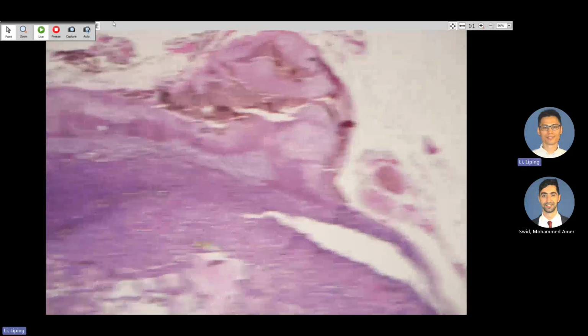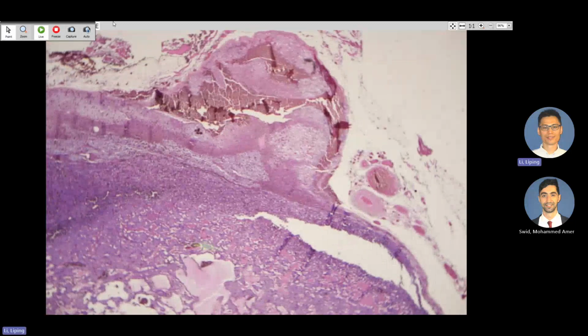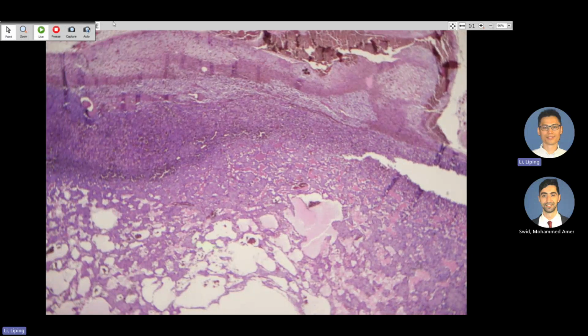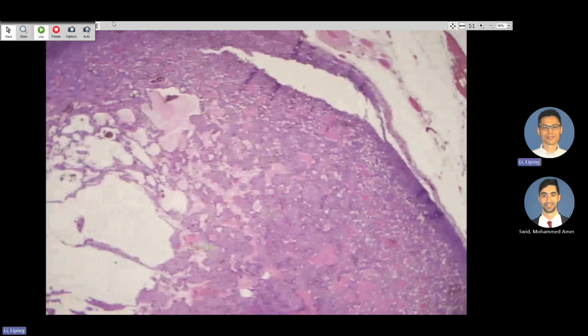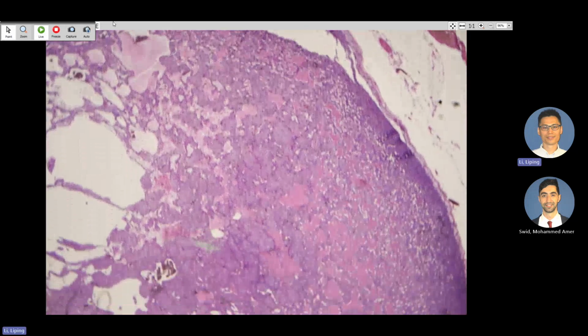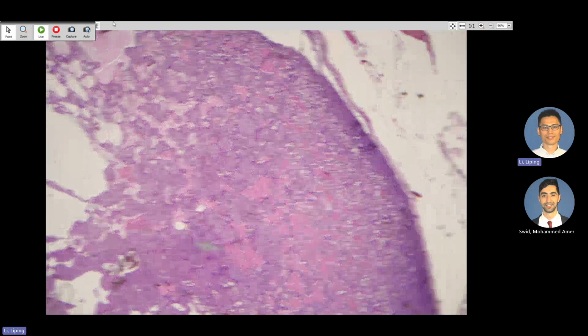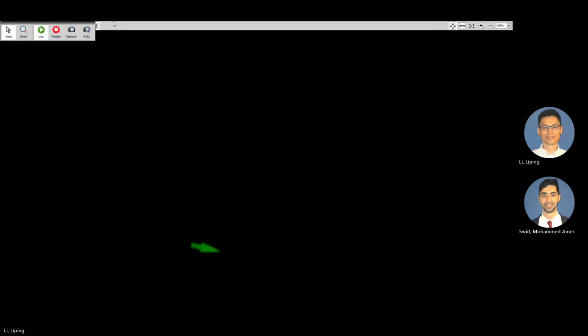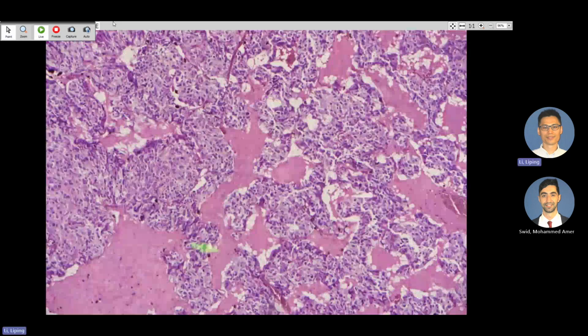Normal adrenal gland, still triangle shape. But this time we have this next proliferation of bluish cells, but these cells are not like neuroblast cells. They have abundant cytoplasm and vasculature full of these vessels.